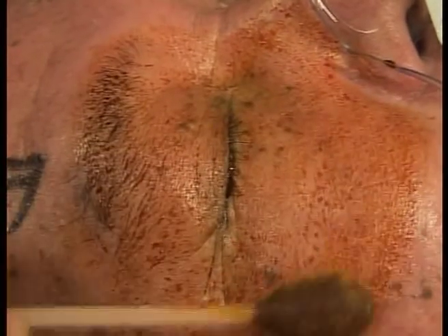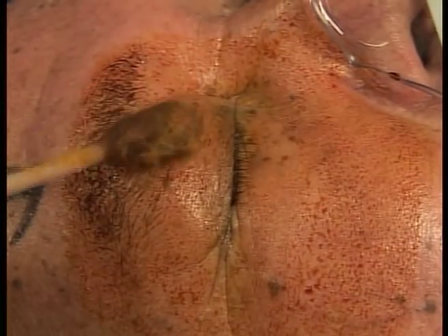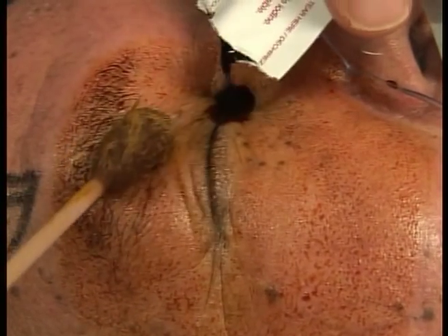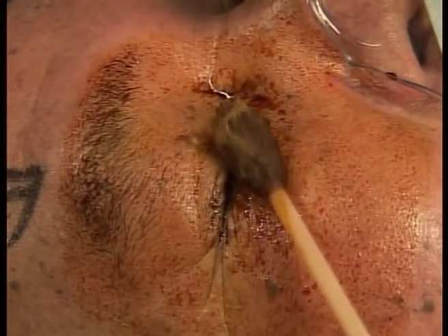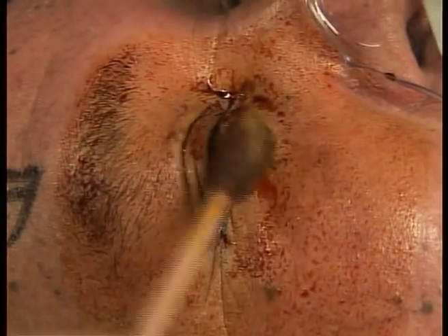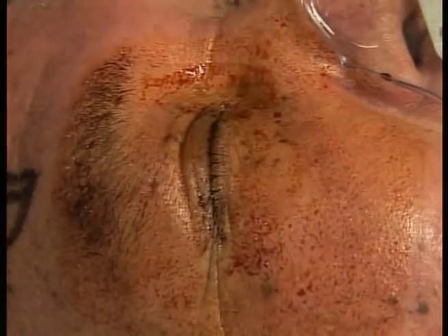The patient has received topical anaesthetic drops with benoxinate or oxybuprocaine, and then antiseptic in the form of a betadine swab is applied. Open your eyes. Sometimes when you swab with these, the bottom eyelid misses out on the antiseptic, so I just ask the patient to look up and then apply some antiseptic to make sure that I get the bottom eyelid, and also that I have some antiseptic in the conjunctival sac, which you can see that I have.